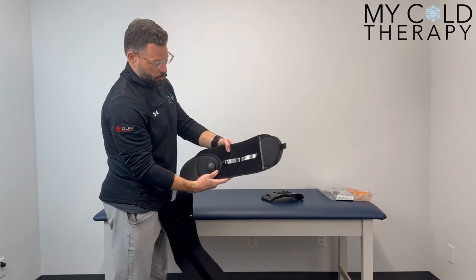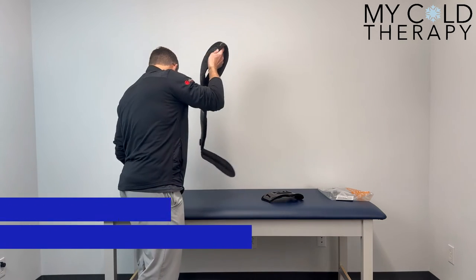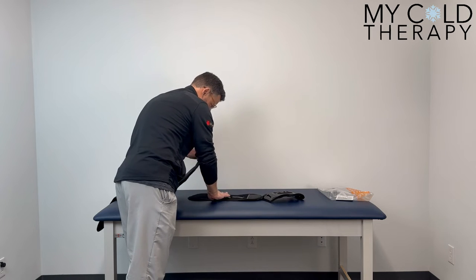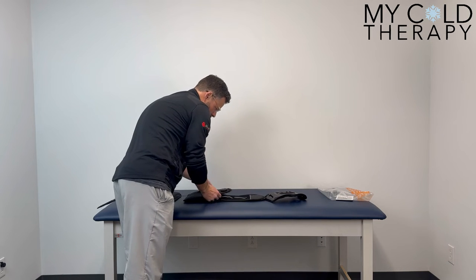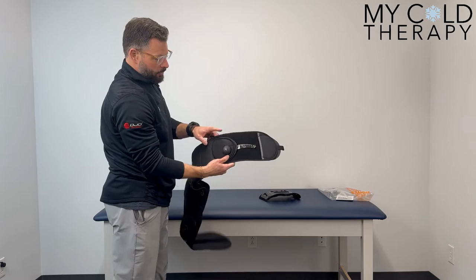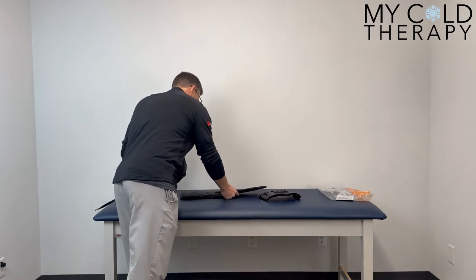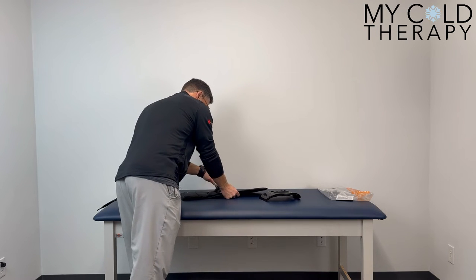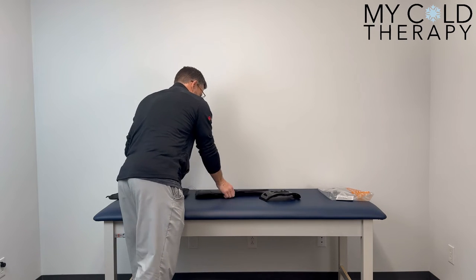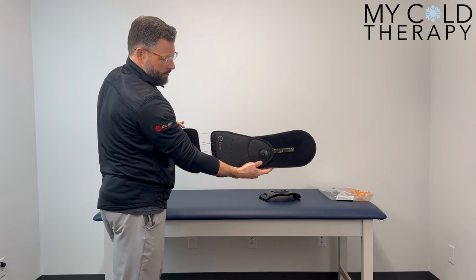On the brace you can see you have your corresponding tapes. We're going to unvelcro this and move it to 36 inches. As you can see we've moved that over to 36 inches, and we're going to do the same on the other side. Now we've got our brace modified for a circumference of the waist up to 36 inches.